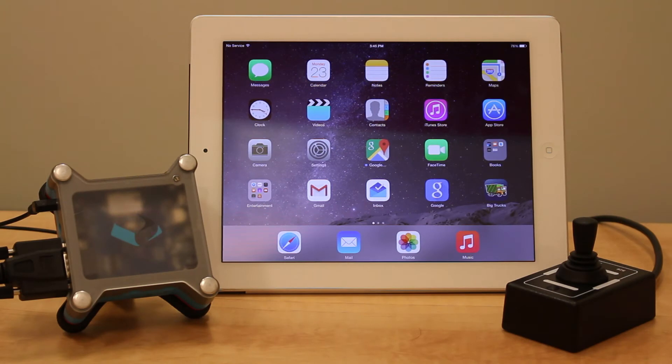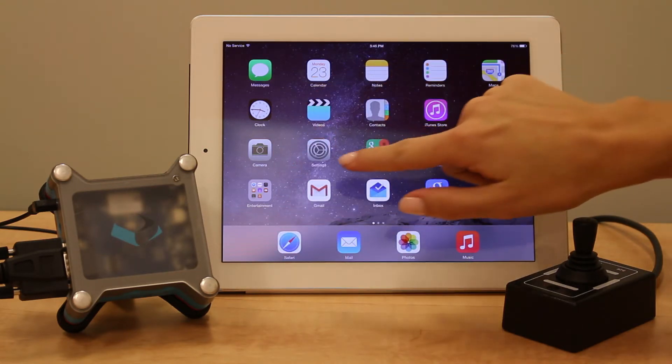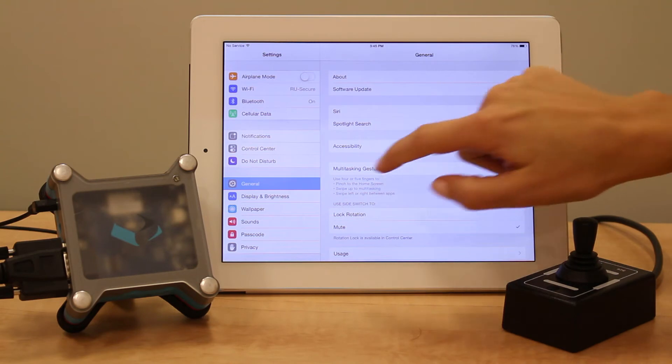To get your iOS device into iOS 4-way mode, you'll first need to pair your device — in this case an iPad — to your Tecla Shield. Make sure the Tecla Shield indicator light is flashing pink. Next, go into Settings and click on Bluetooth and turn it on.